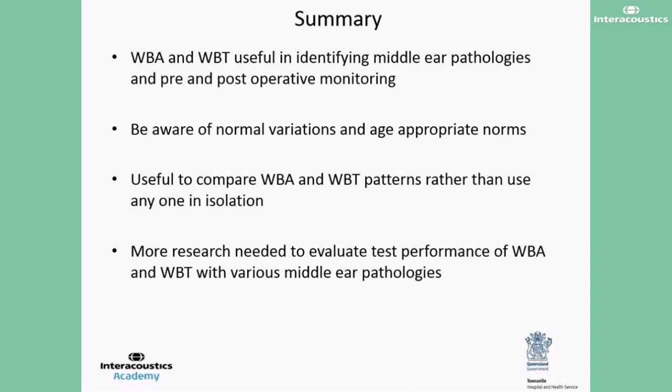It's quite interesting to see that wideband tympanometry is really showing a lot of potential in terms of otitis media, and hopefully we can see it in the application of other middle ear disorders as well.